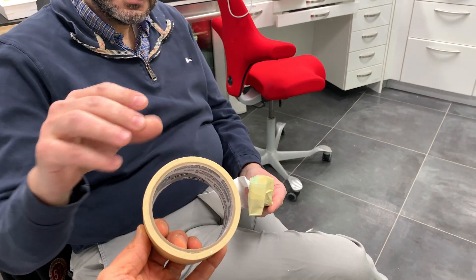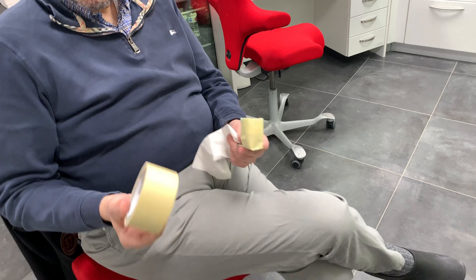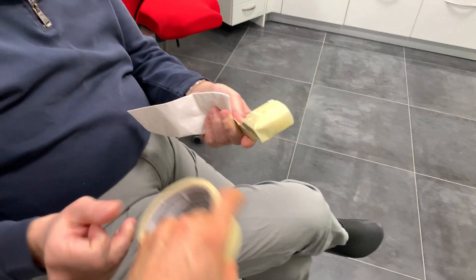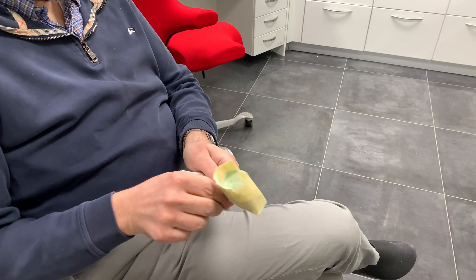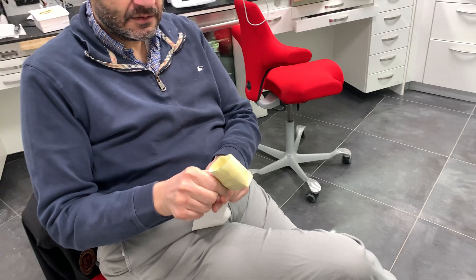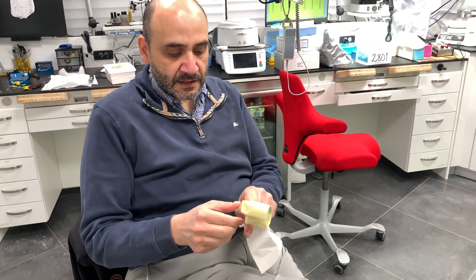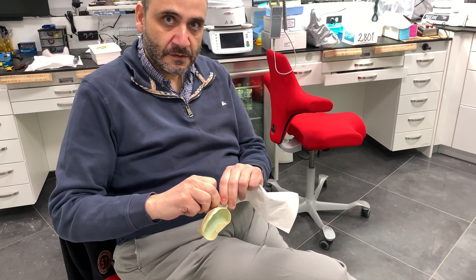The masking tape technique — I love it, it's state-of-the-art. Take a piece of masking tape and wrap it around. The tray has to be dry, of course it's disinfected and dry, and excess impression material is trimmed before. So what do you use, like an 11 blade or something?